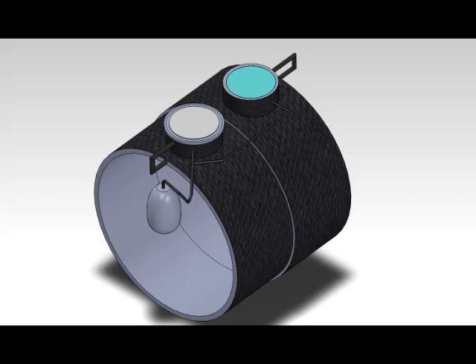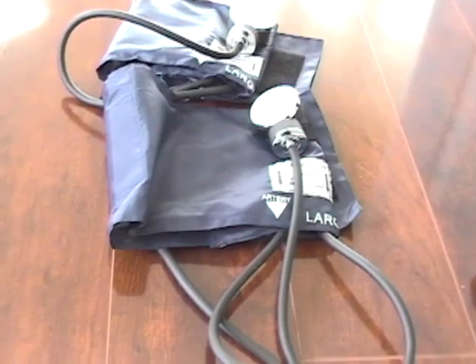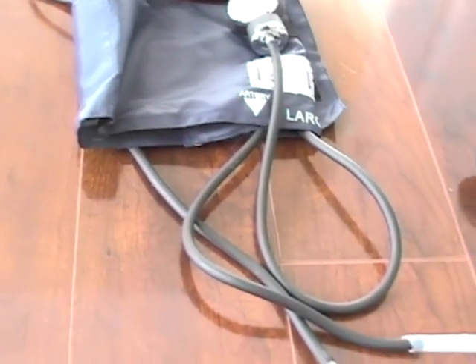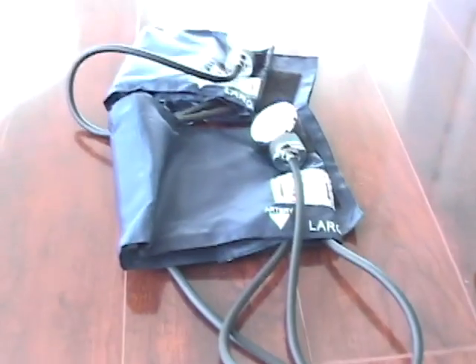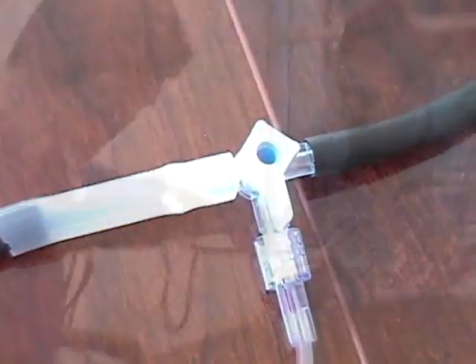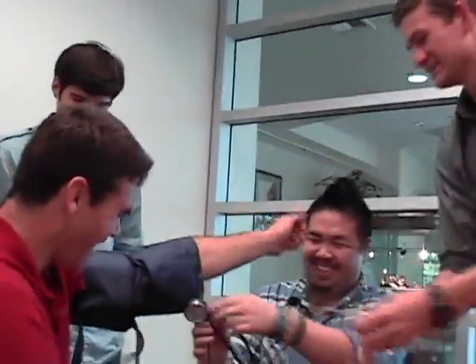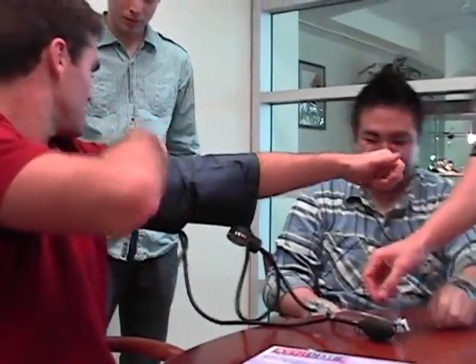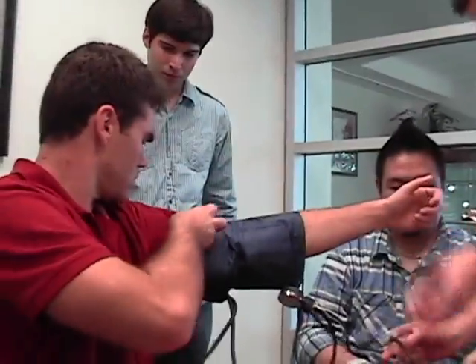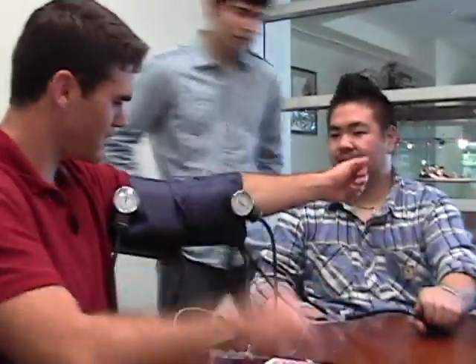We considered a variety of different designs before deciding on our prototype. For our first prototype, we constructed a double cuff sphygmomanometer connected together to a single hand pump. The lower cuff acts as a pulse detector, while the upper cuff provides a pressure reading. The issue with this prototype is that it took a significant amount of time to pump, only achieved a very weak detection signal, and was much too large and bulky, making it confusing to use.